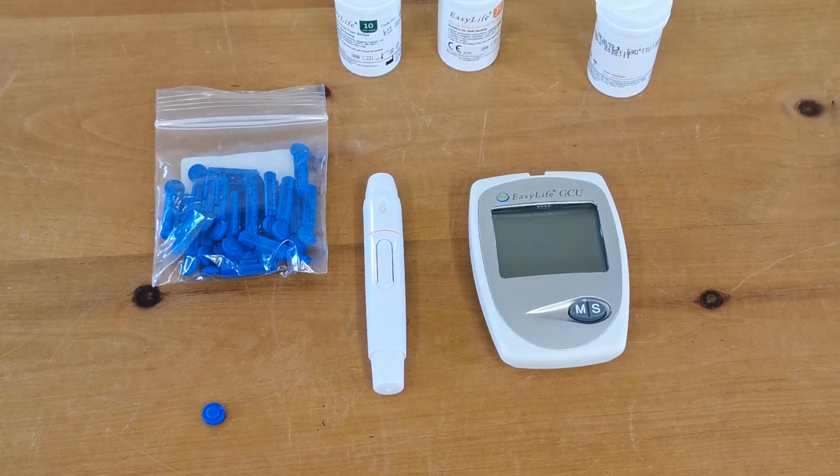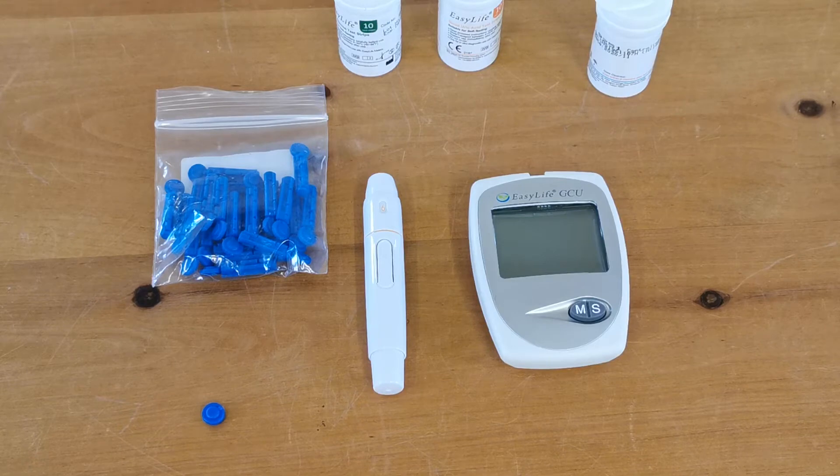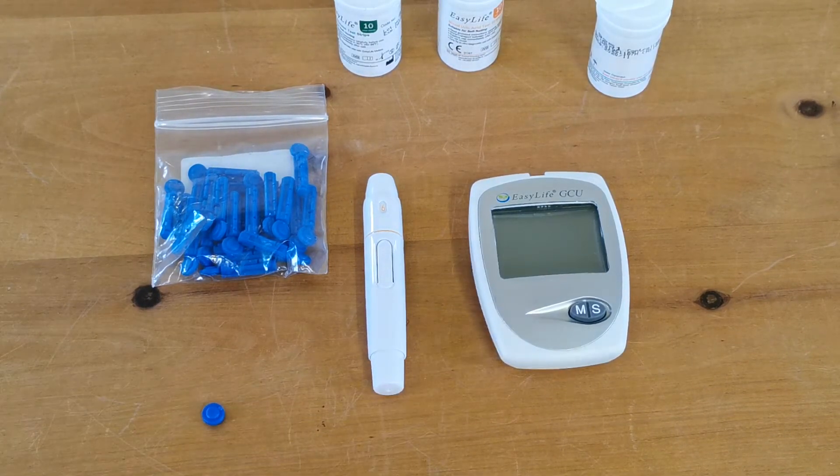We're just going to do a little supplementary video. We've run a cholesterol test on this meter, which you've probably seen in the previous video. We're just going to show you a couple of things now: one, to sort out your lancet that you've used, and two, the function on the meter for recalling the memory.